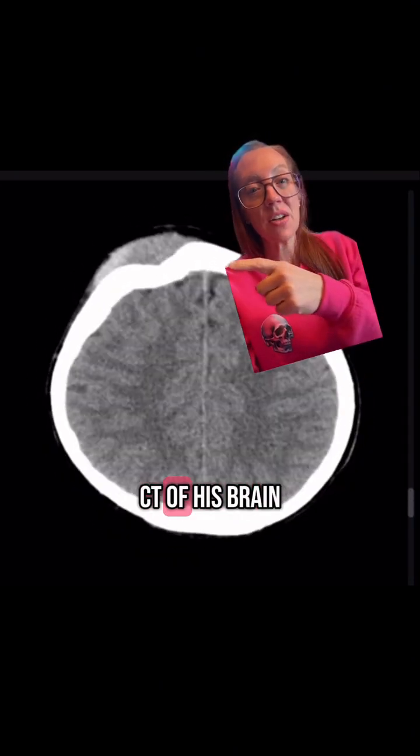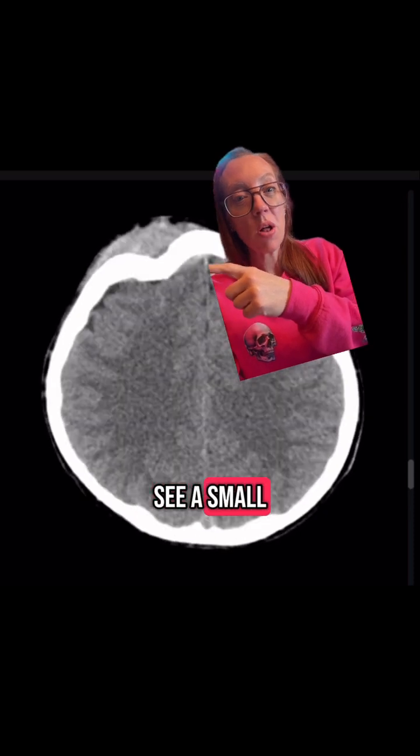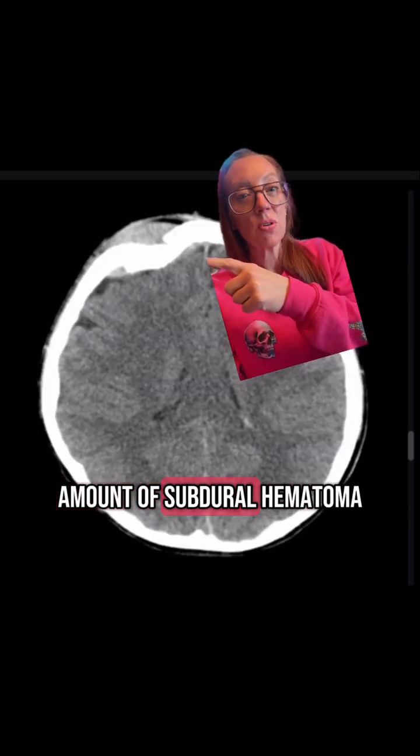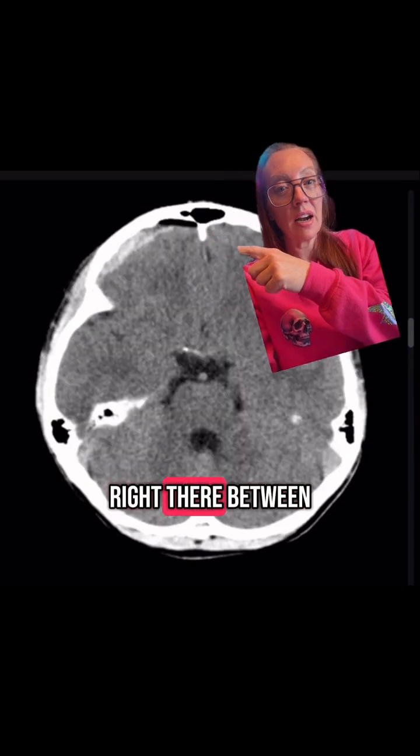Following this is a CT of his brain where you can see a small amount of subdural hematoma up underneath that skull fracture, right there between his skull and his brain.